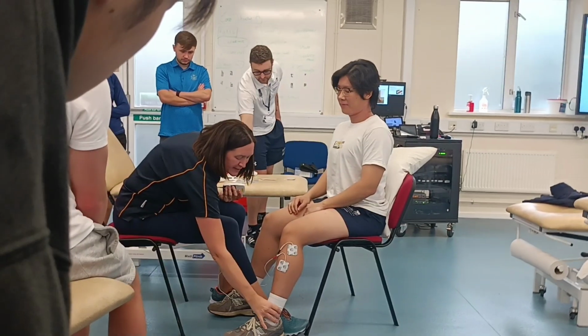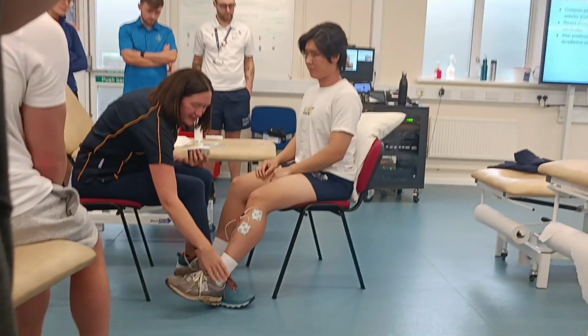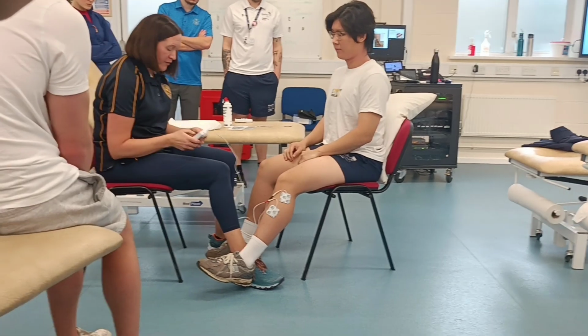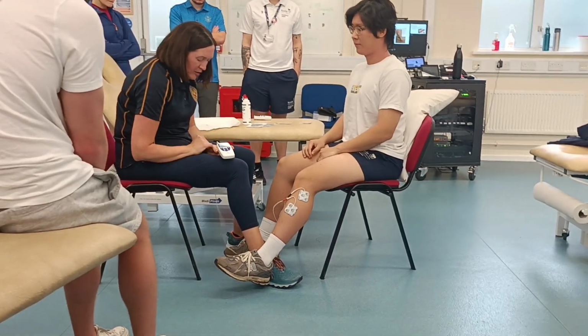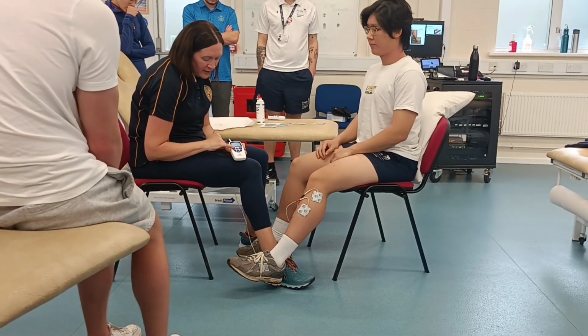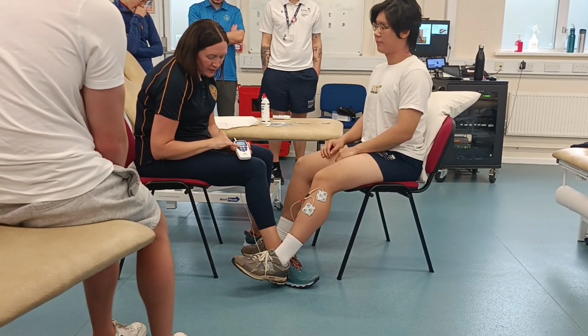So generally, if I sat on the side, I have my patient's foot resting on my foot. You can keep the shoes and socks on. You don't need to take them off. Okay. My machine's turned itself off again now. All I'm going to do to increase the intensity is I'm going to do the plus button.